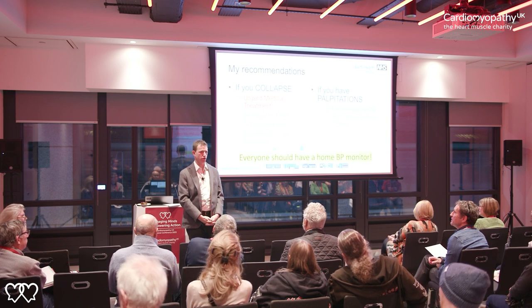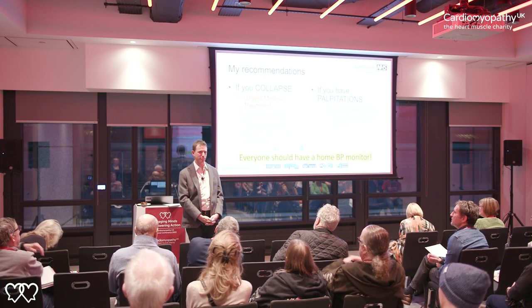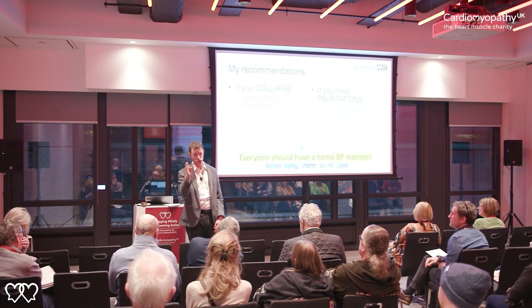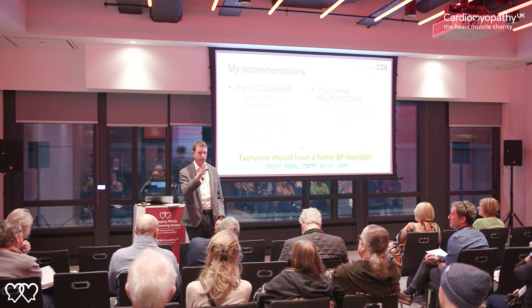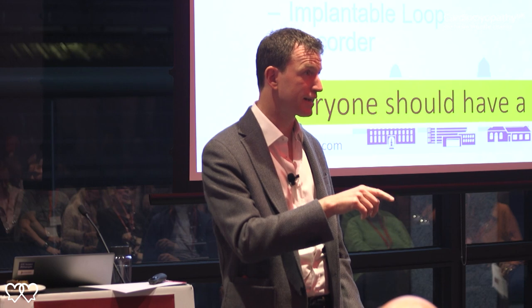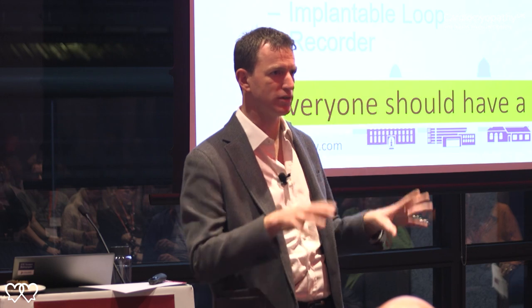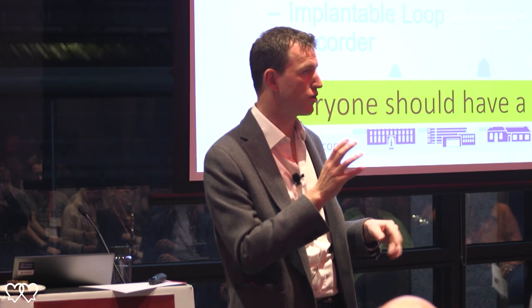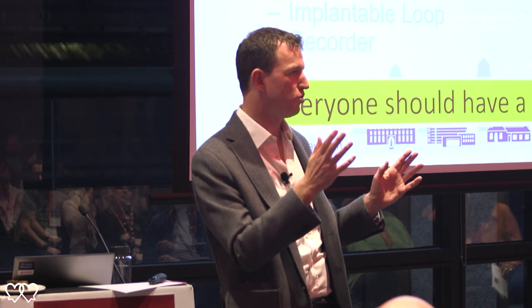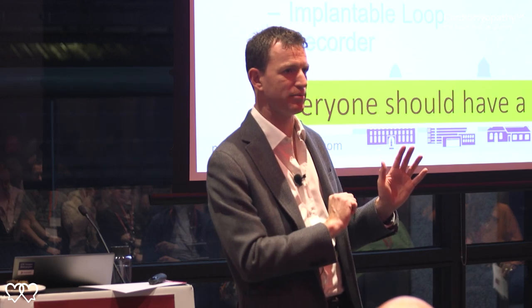Okay, so I think what you point to is an assumption that I always make, that this is all digital stuff behind it. Basically, we rely on the 48-hour Holter up to 72-hour. Then it comes on a computer screen, and we have a technician click through. You can see about 20 minutes at a time on one screen, and if there's things that jump out, it is alerted. So there is a pre-screening process, right? And so seeing normal ECG is fine. And then I'll go, right, select that bit, select that bit, as examples.